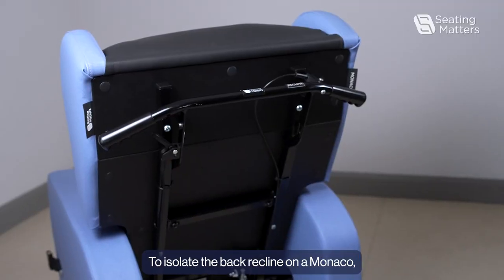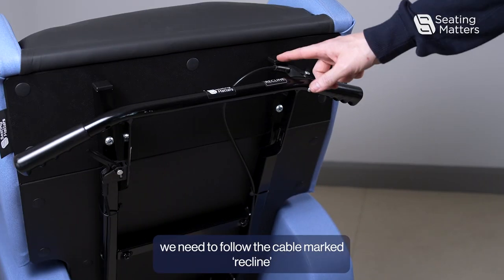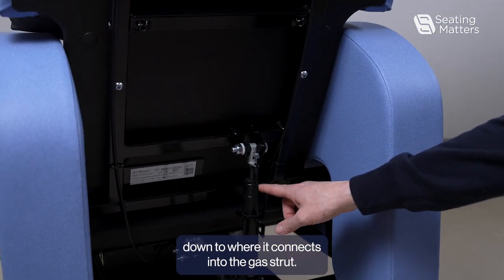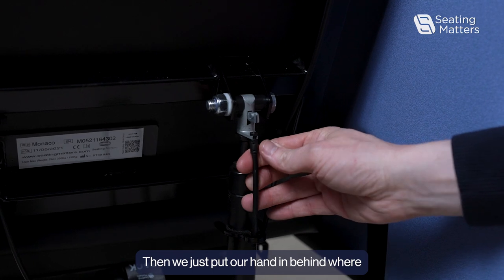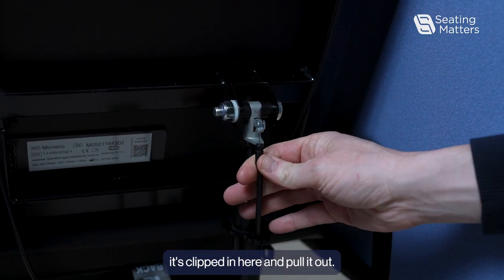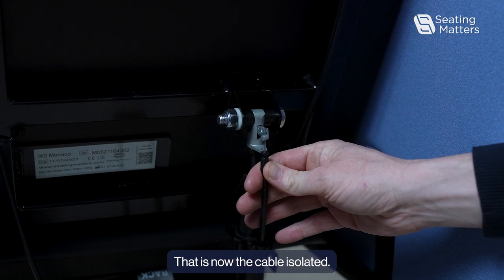To isolate the back recline on a Monaco, we need to follow the cable marked recline down to where it connects to the gas strut. Then we just put our hand in behind where it's clipped in and pull it out. That is now the cable isolated.